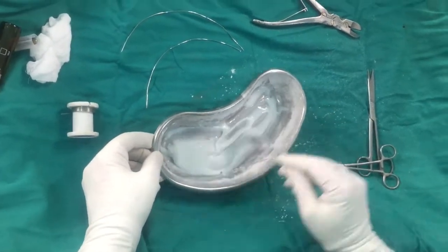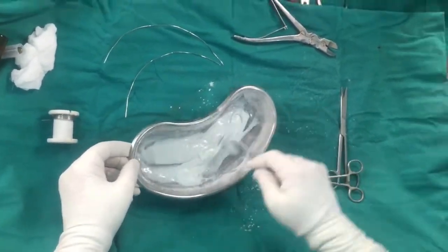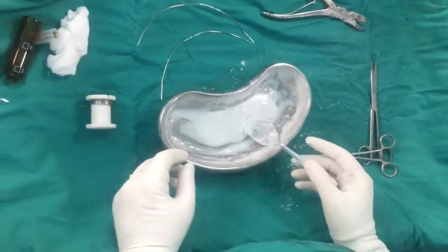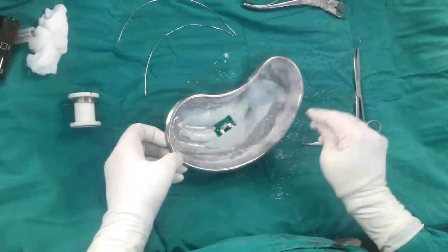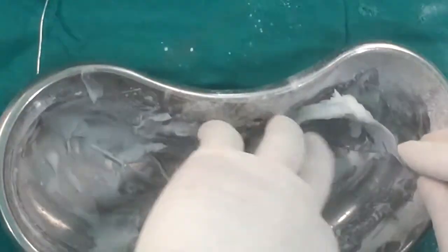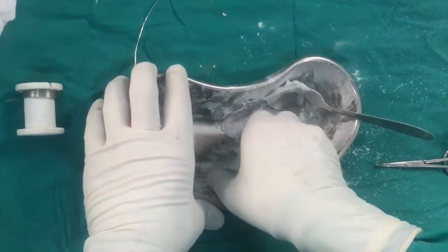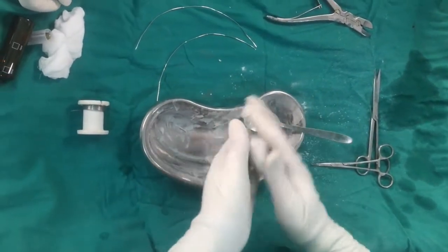It will take around three to four minutes to reach the doughy state of cement. When we are approaching the doughy state, we check whether the cement is sticky to our gloves or not. We have to wait until the cement is no longer sticky to our gloves — that is the doughy state of cement.